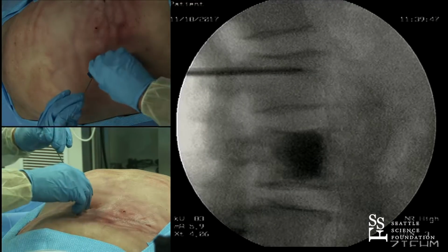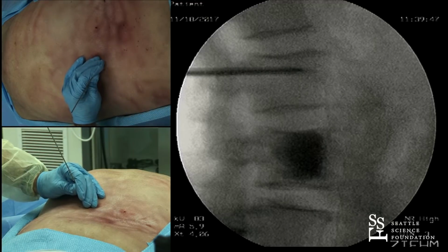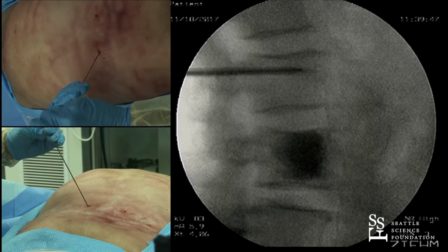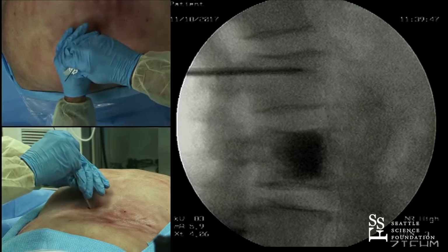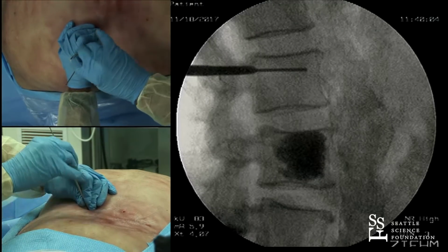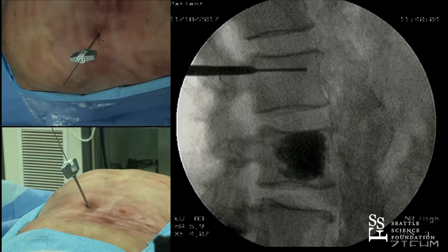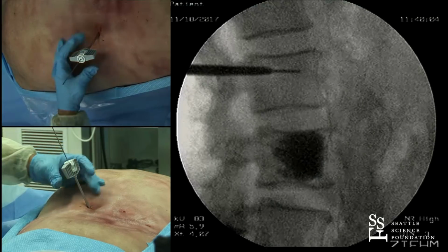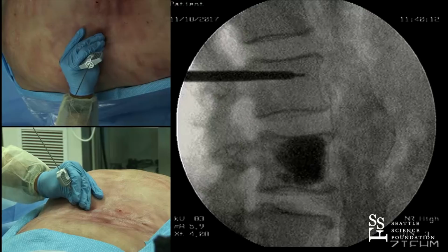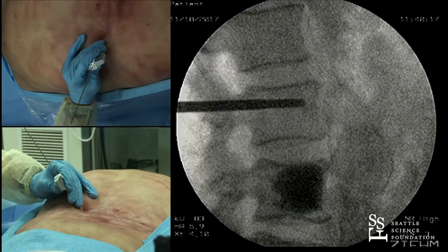Yeah, the same process occurs when orthopedic surgeons remove screws from bone. From outside in, it closes in over a period of time. This, of course, has a hole for the K-wire in it. And during that 6-week period of time, you can refracture through a plate hole, a screw hole. But routinely, with the cement augmentation, the bone is now so strong, the pedicle is secondarily protected.